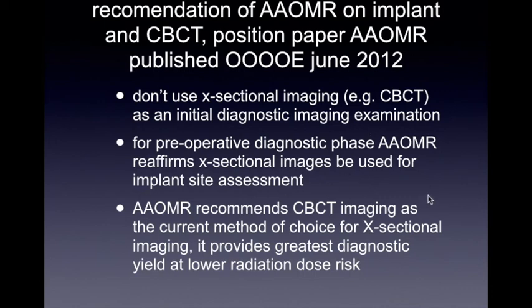For those that do implants, this would be very logical as in the past, when we took plain film radiographs, we oftentimes would see only a limited amount of bone, since we need to have a general idea of the three-dimensional morphology of our implant site. Plain film radiographs before cannot be a sole determinant or diagnostic aid for implant site assessment and planning.